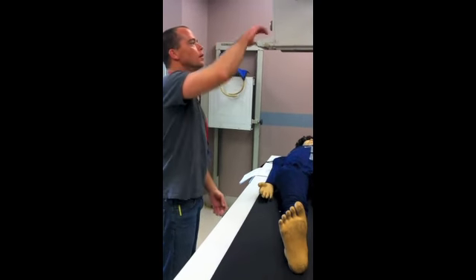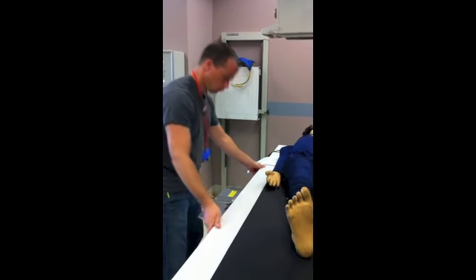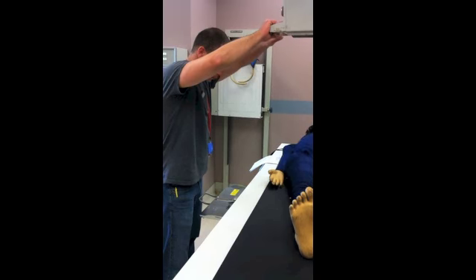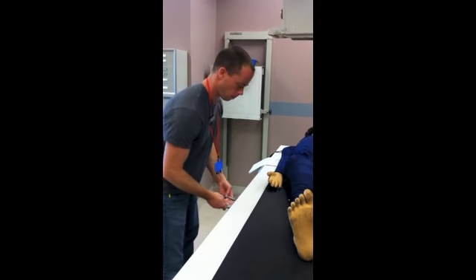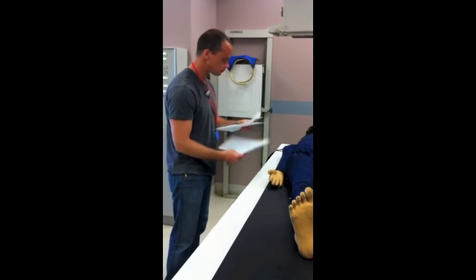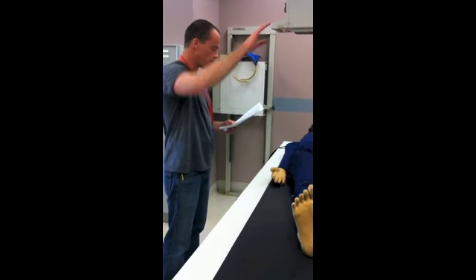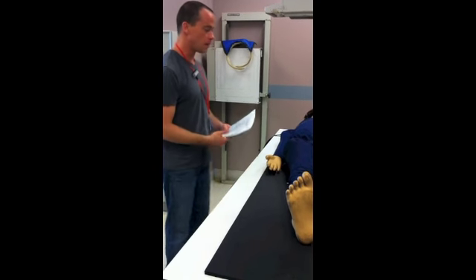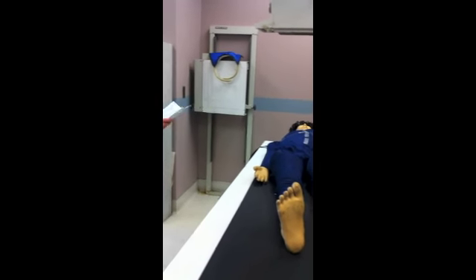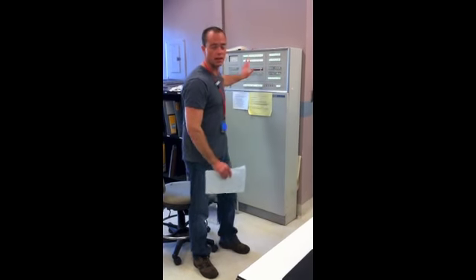Check. Okay, we have proper detenting of the tube, IR is in the bucky, the patient is on the table, and time to set up the console. For an AP knee, I like to do 65 and 5.